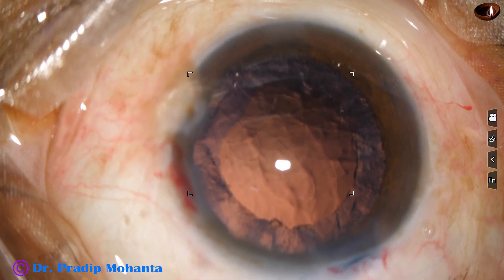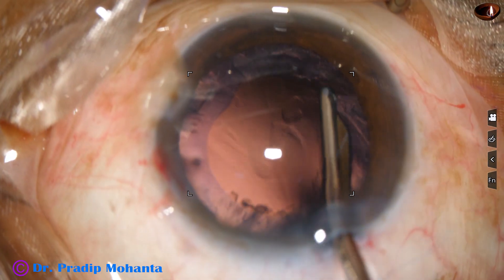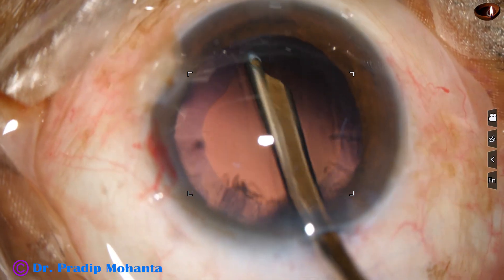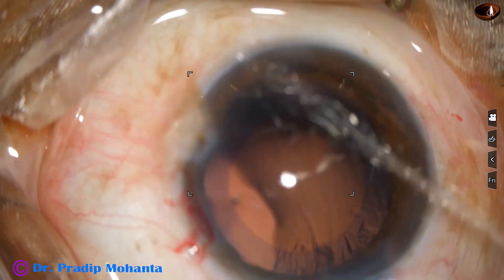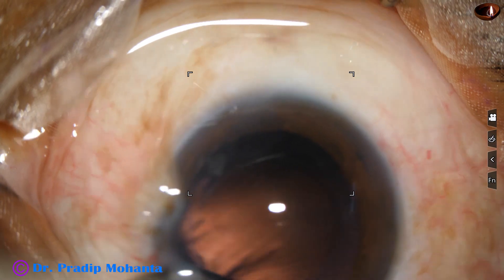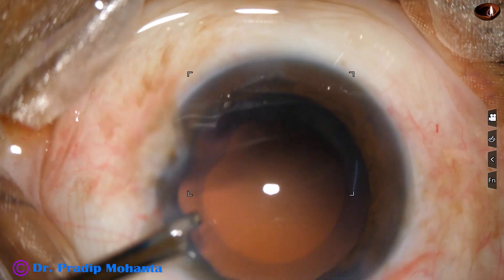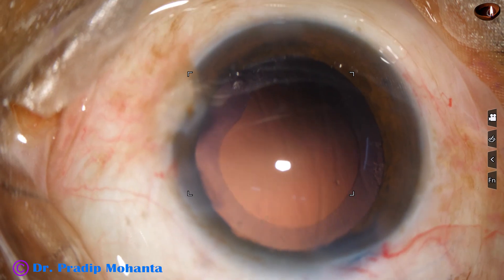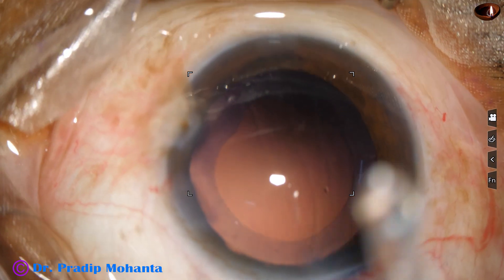Now is the time to aspirate the cortical lens matter. I am using a 23G Simcoe cannula. I have used viscoelastic so that the anterior chamber remains formed when I go through the main port. And now I go through the side port and remove the sub-incisional cortex. The side ports are three clock hours away from the main incision, and astigmatism produced by the main incision is neutralized to some extent by the side ports.